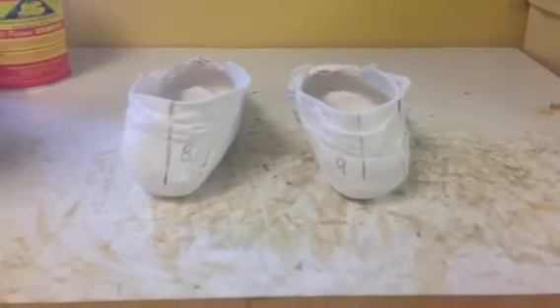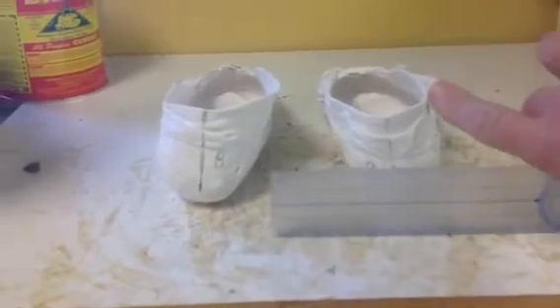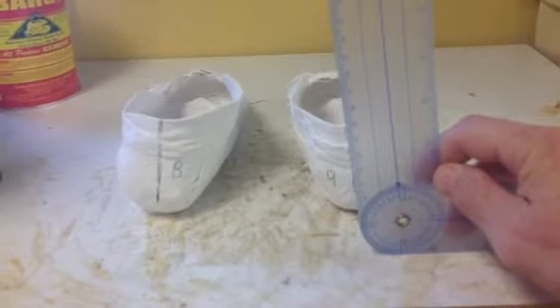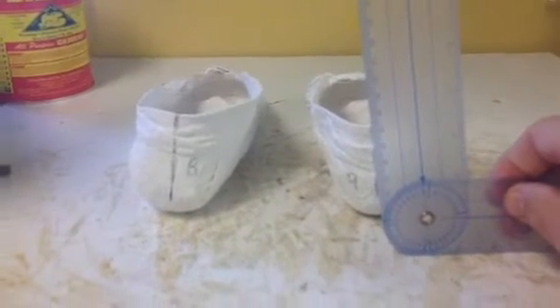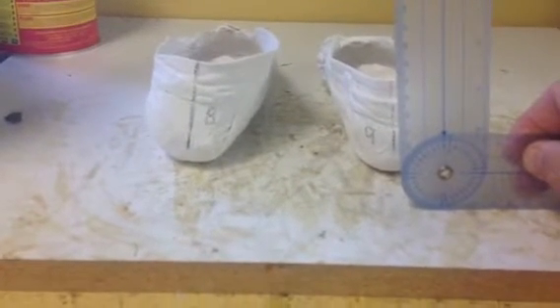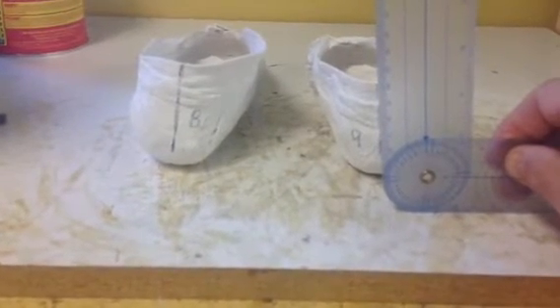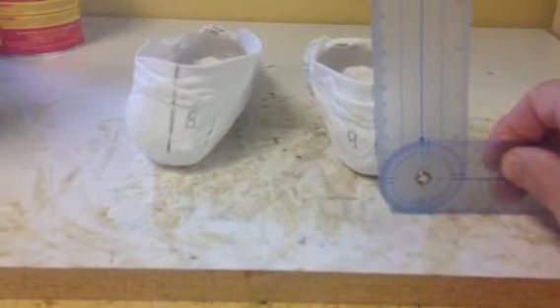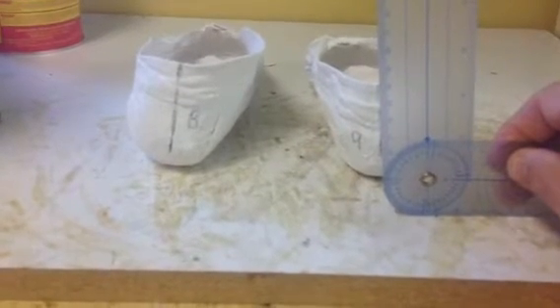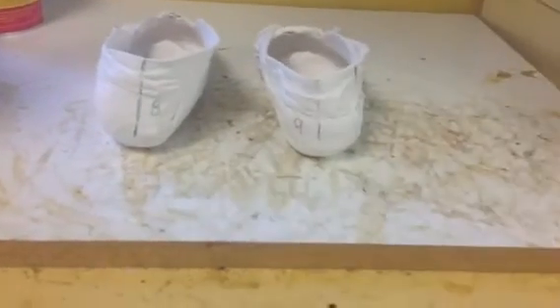You'll see how it rotates in a pronation direction. You measure that, and that gives you the amount of forefoot varus captured in the cast. You can easily measure the angles. I've pre-measured these where the right side is 9 degrees everted, which means a 9-degree forefoot varus was captured, and the left foot is 8 degrees everted.